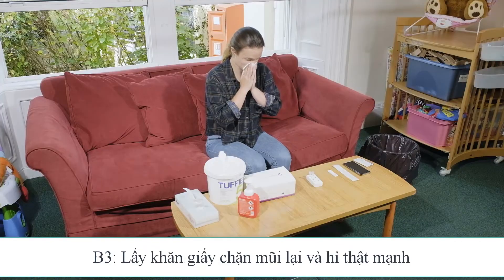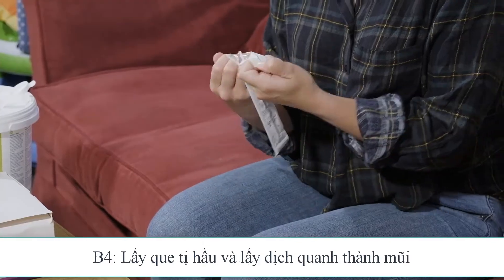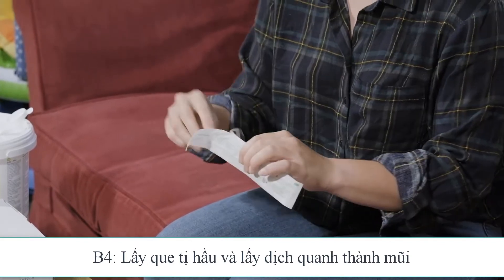You should blow your nose before taking the test. Take the swab out of the packet, keeping the cotton bud end clean.